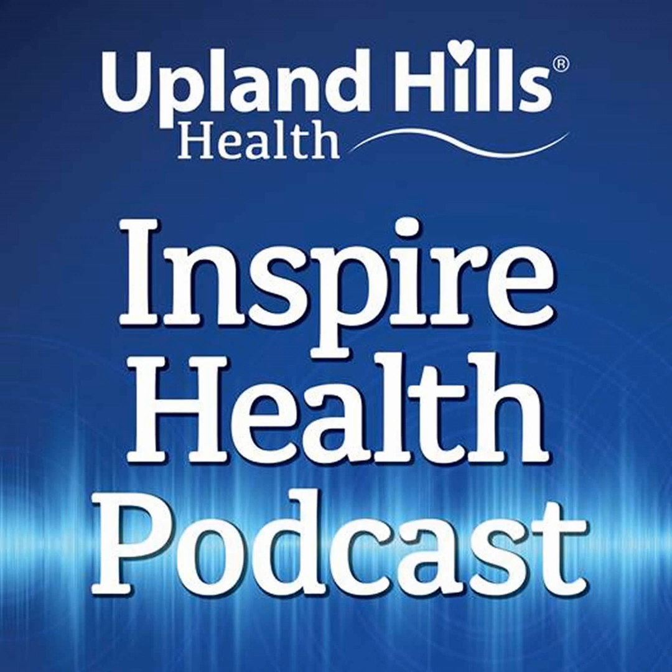Basically, what we tell people to do is to start it out with maybe a minute or two on it when you're awake in a comfortable setting, like the living room, when you're just chilling out watching TV. That is the best way to get through desensitizing your CPAP. And then work yourself up to where you can wear this CPAP for anywhere from 30 to 40 minutes, which is ideal, without having any claustrophobic issues. So every few days you're going to add a few minutes.